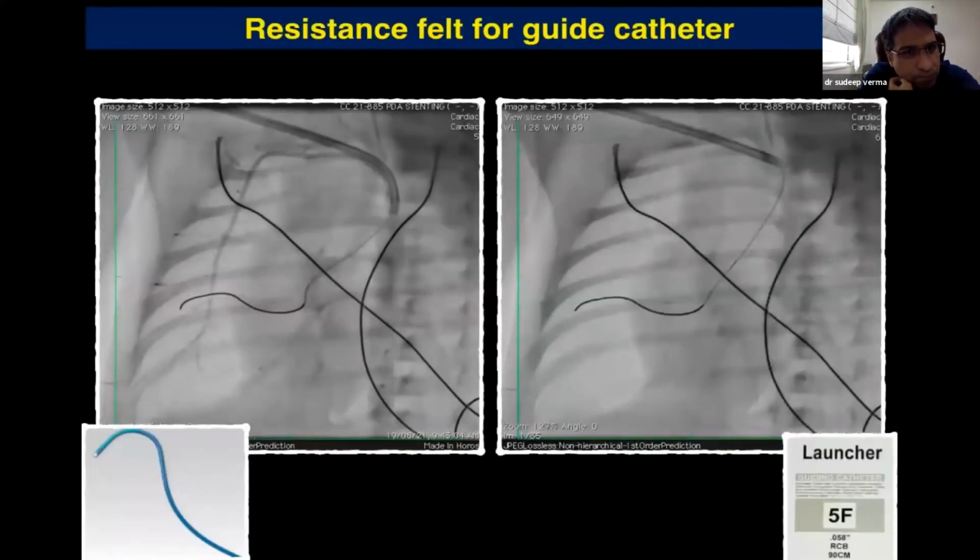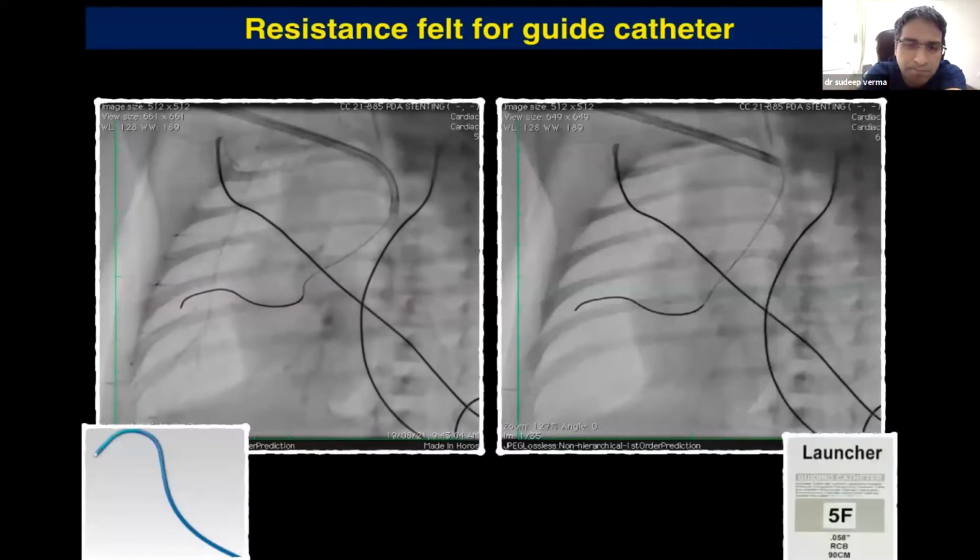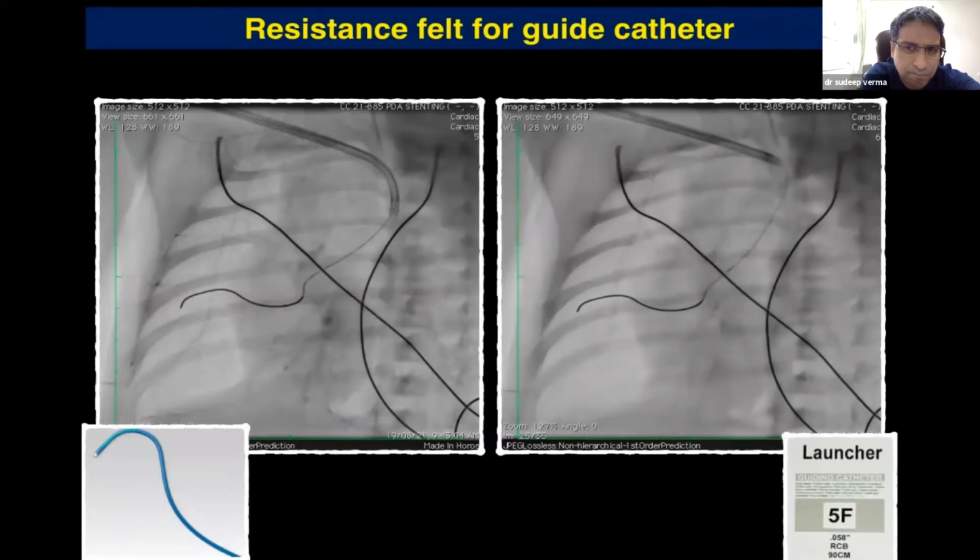But when we thought now we are into the PA, we thought we'll put a guide and then put the stent. As a routine, we put the guide when it's tortuous; we are able to put the guide at the mouth, but it may not be necessary because many of us may go directly with the stent. But before, we used to do that and we found out sometimes the stent won't go into the tortuous duct. So we applied the method of putting the guide at the PDA mouth and then putting the stent.